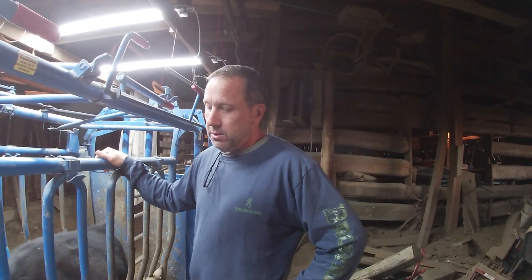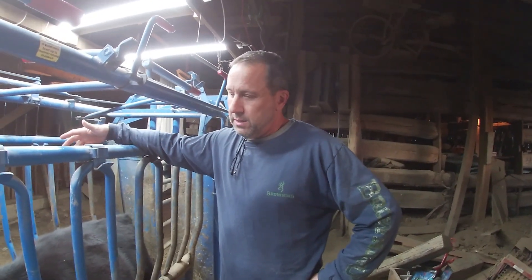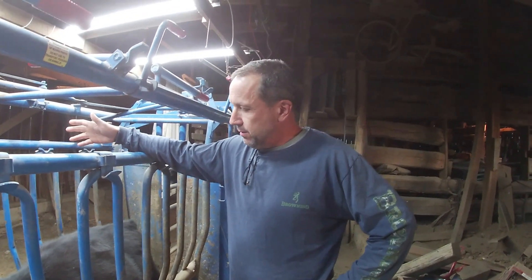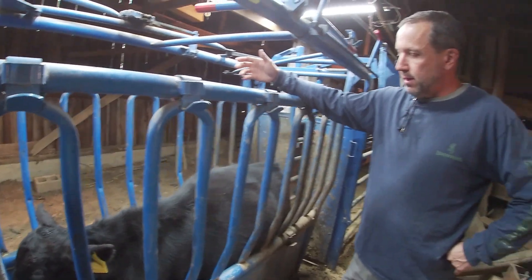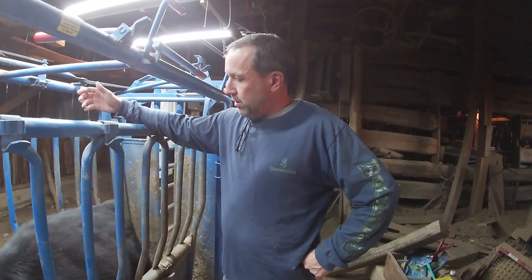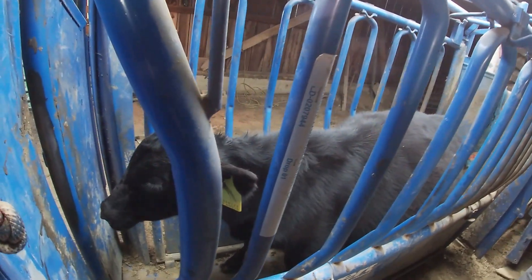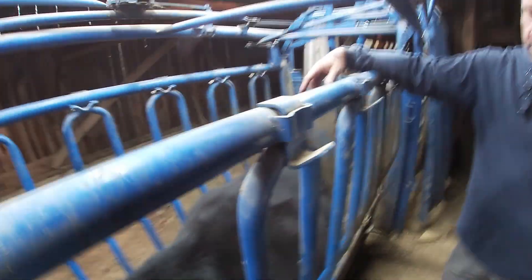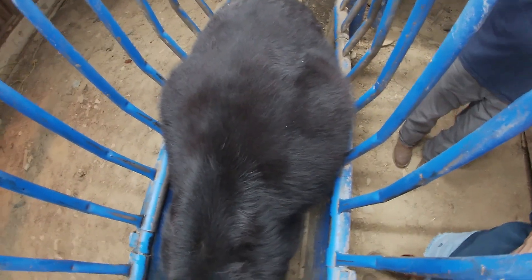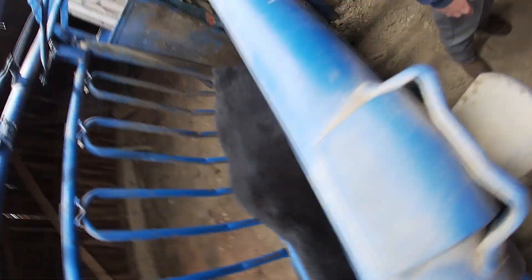This calf bloated two weeks ago. I tubed him and gave him a shot and he was fine. Then he bloated again yesterday, I tubed him, he went down, I gave him all the other treatments and he's back bloated again now. It could be something he's eating, could be nuts falling off a tree — you never know. Hopefully this trocar will take care of it. If not, we've wasted our money with the vet, but you've got to try before you end up putting him down.